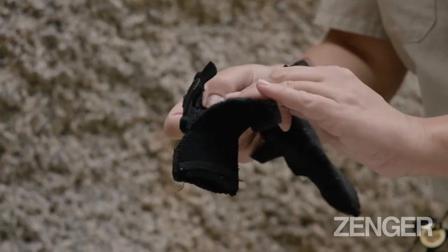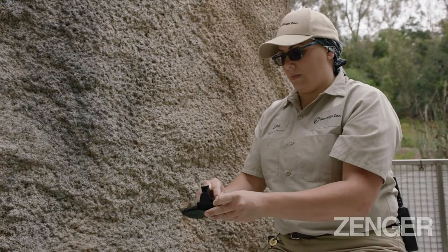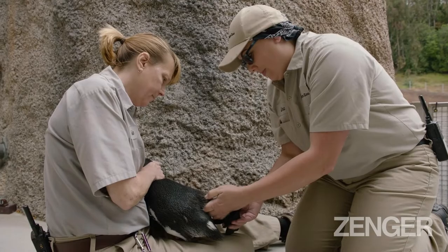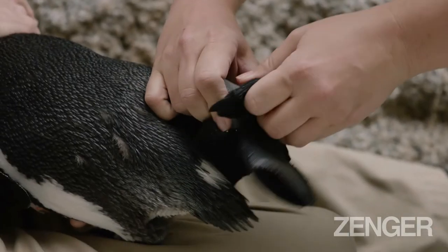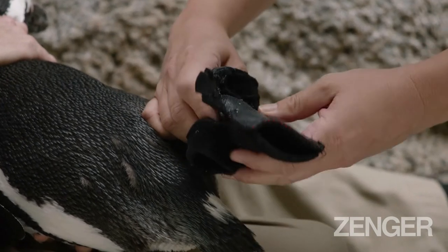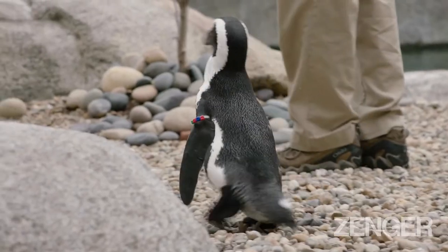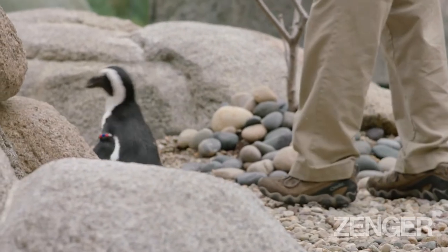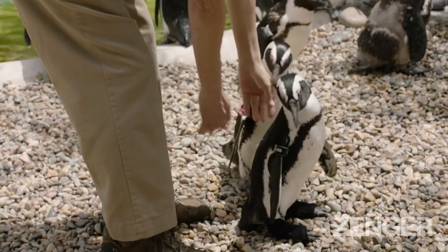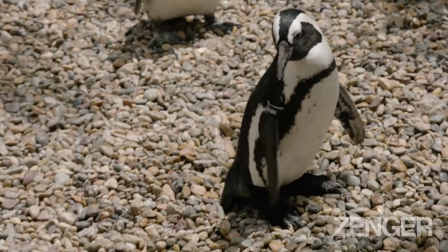We're gonna take the white strips off. You have to take the white strips off. Let's go for this one — you have to go for the beach. You should have three different ones now for us.